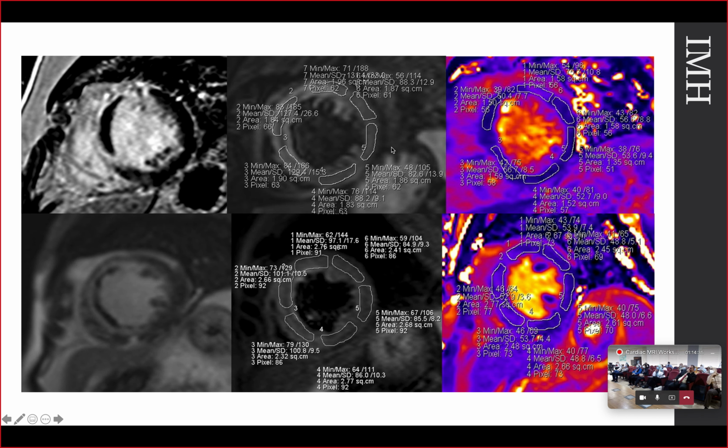And this is another example, for another patient who had an LAD infarction with a large MVO. This is the STIR in the middle, and on the right side is the T2 map. As you may see, we would expect high signal intensity in the edema area, but the T2 map is showing a value of 50, which contradicts edema, and this is because of the presence of hemorrhage.